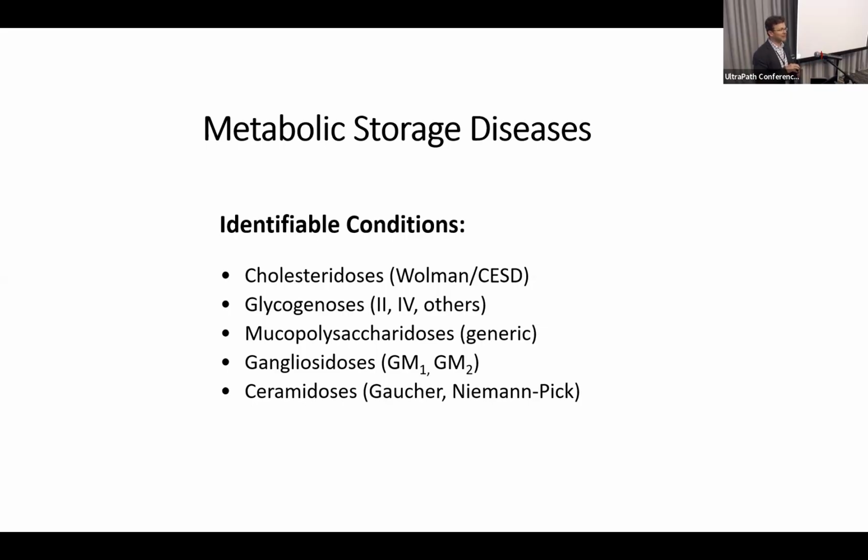But occasionally there would be something where we might say, you know what, it looks like this tumor has some neuroendocrine granules in here. Did you guys think about that? Something along those lines. But we're having trouble keeping up with our volume to have time to do some of those QA initiatives.